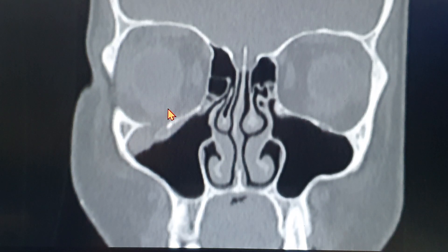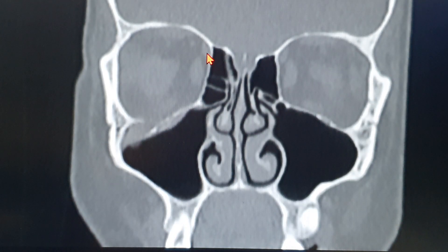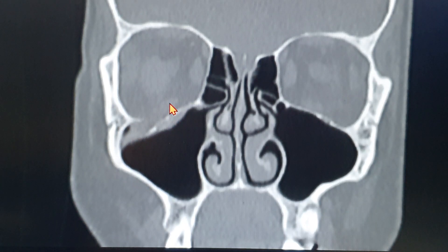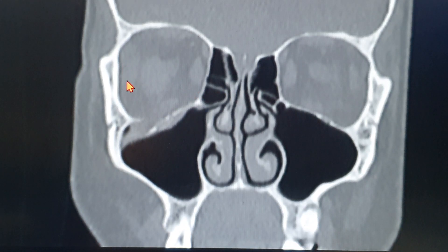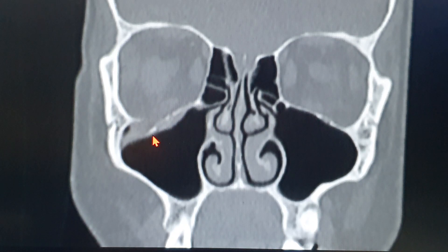That's the inferior rectus muscle, that's the superior rectus muscle, and when you see the anterior ethmoidal artery you can start seeing the superior oblique muscle as well. More prominently, that's the inferior rectus muscle, and you can see the optic nerve starting to appear, and that's the lateral rectus muscle. The inferior rectus muscle is properly within the orbit, and you can see a huge fracture segment — the entire segment of the floor of the orbit has fractured and become an altogether different segment. Compare the same on the left side — it's completely intact.